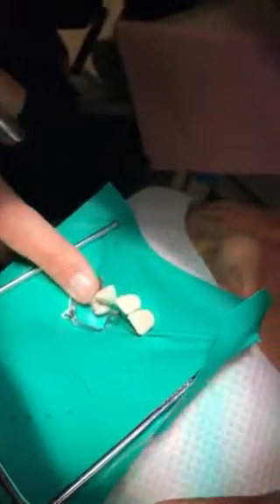But the important thing is always to go from the lingual and then over the buccal, because if you remember your anatomy, you're probably just learning this in anatomy, there's a height of contour. The lingual is usually smoother, and then the buccal part usually has like a lump on the buccal portion. It's wider on that side. So it's easier if you go from the lingual and then come over that hump to the buccal. Okay, so that's one side.